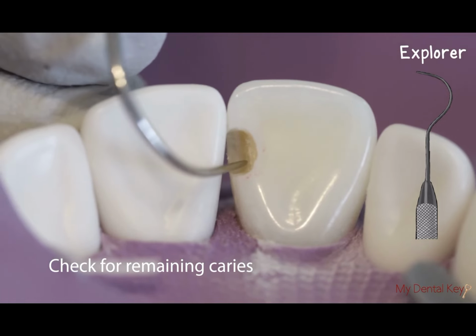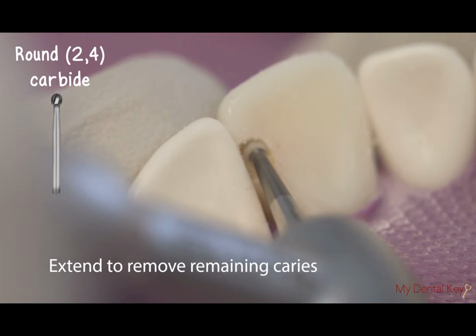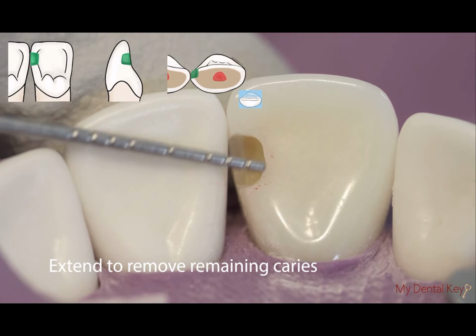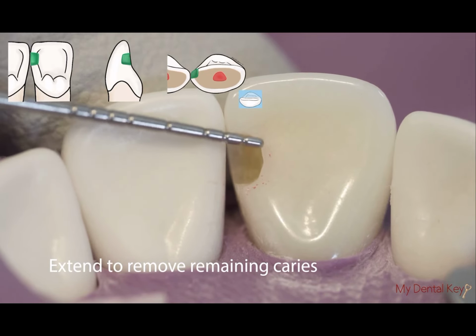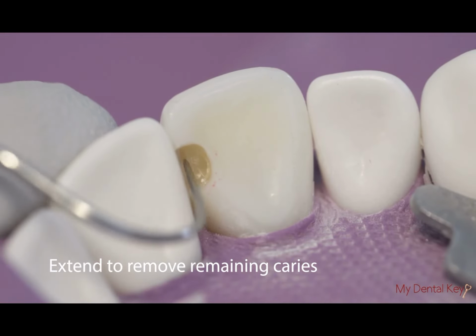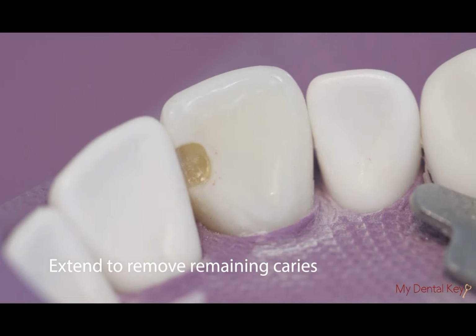axial wall. In order to remove the caries, you will use the largest round burr that fits in the preparation, maybe a size 2 or 4. As you extend the preparation, ensure that you are still within the preparation dimensions as identified in the candidate manual. Continue to check for caries tactily and remove the caries as needed.